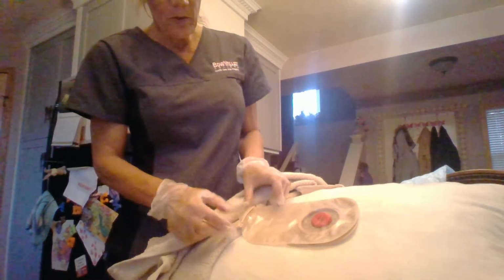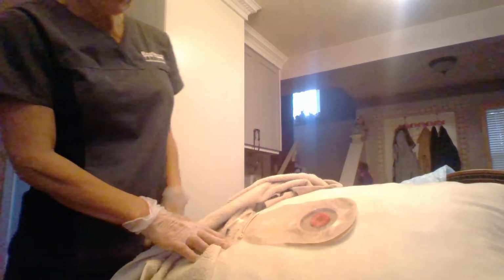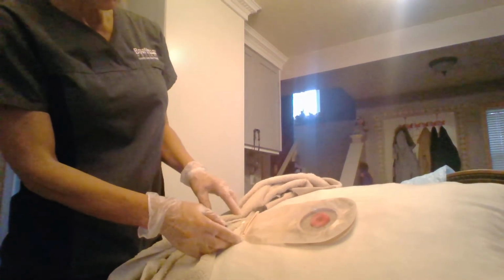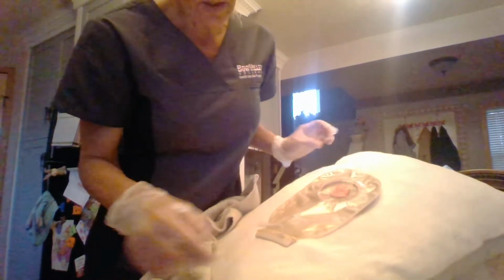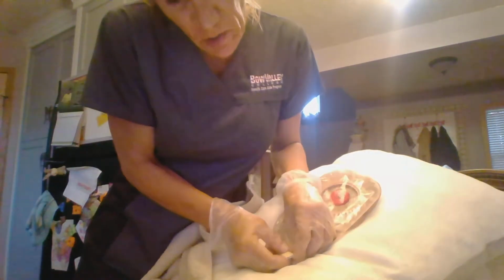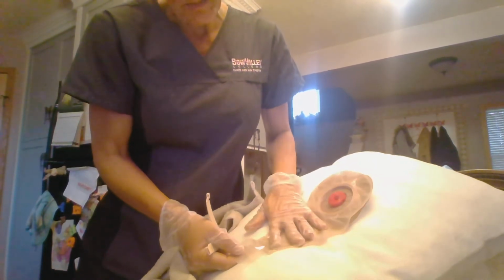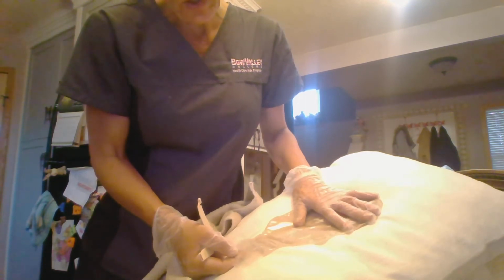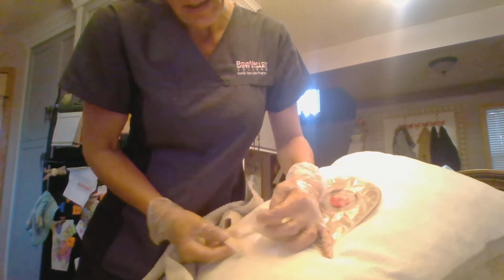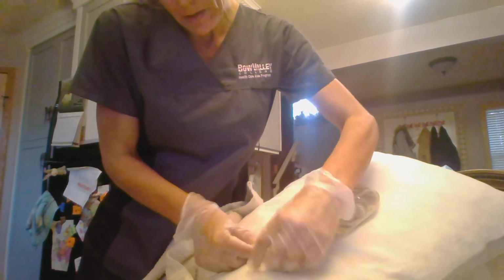Once you have that into place, make sure you check this system itself, the pouch itself. You could therefore have completed your task. But I want to open this up and show you what you can actually do. And it turned this way. Now what happens is that if we wanted to empty a bag, if we took this bag off or it was attached to a client, I have to put this back on here.